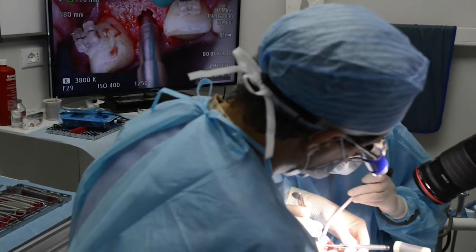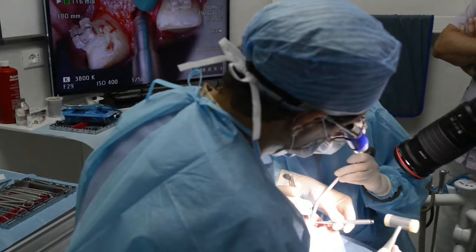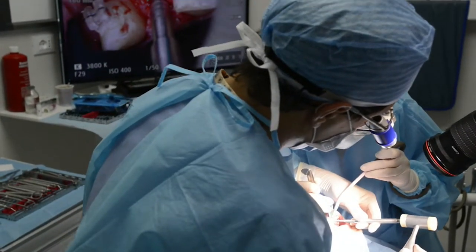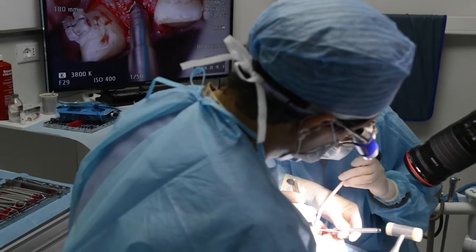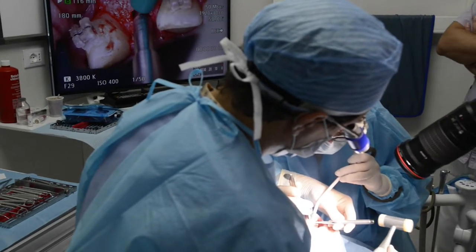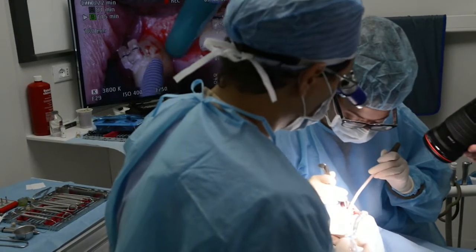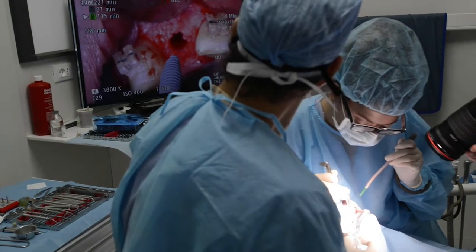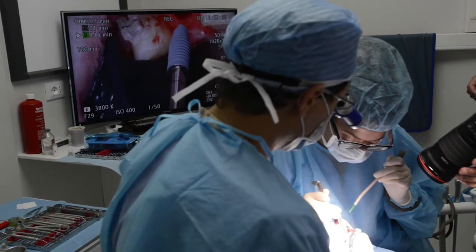This was during live surgery in Rome, just to compress the native bone, which is softer compared to the augmented bone. So the osteotomes are used just to compress the native bone. The initial preparation of osteotomy sites is done by the combination of twist drill and taper drill, always trying to under-prep the sites a little bit so that I can give the prosthodontist the chance to eventually do immediate loading.